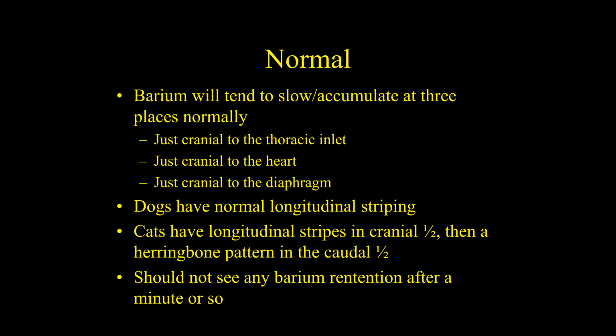And the bolus of contrast in a big dog will start off, they'll swallow it, you'll see it go down into the pharyngeal region. It flips the epiglottis. It starts off in the cervical esophagus, and that bolus of contrast you can see move in real time from the cervical region into the stomach, maybe in about 10 seconds. It goes right down and bloop, falls into the stomach. Then another bolus comes right after it, bloop, falls into the stomach.